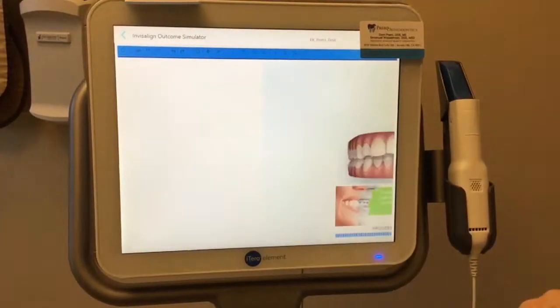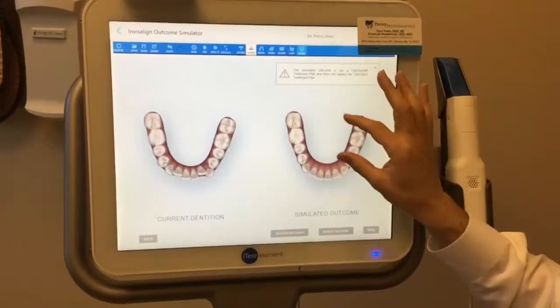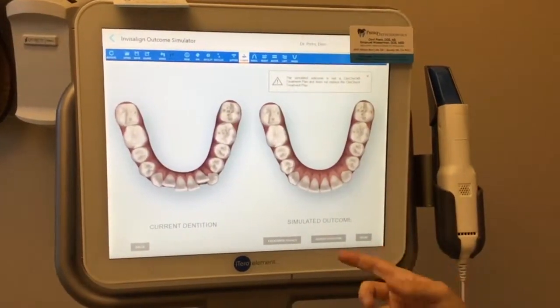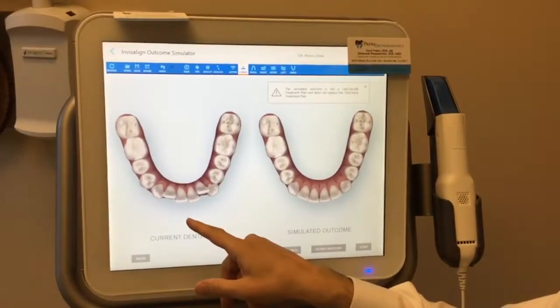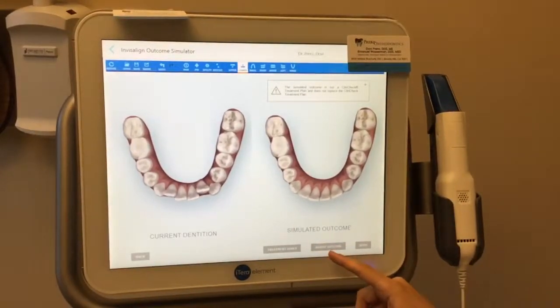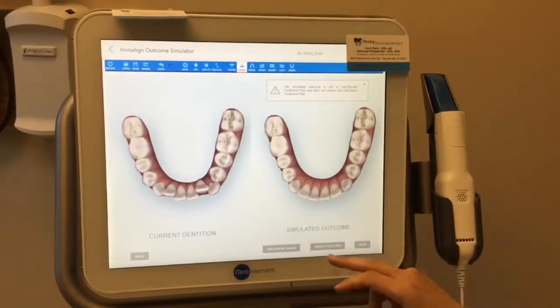So as the scan finishes, very often the first thing we go to is, I love going to the occlusals first. Very often, patients always have lower incisor crowding, and so this will show them very powerfully what needs to be done. Now this patient has severe crowding. Some people may be comfortable with treating it non-extraction, but for our purposes, we're going to be treating it extraction. So the first option was saying, oh, we can level and align the teeth.